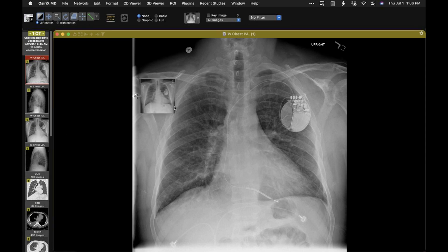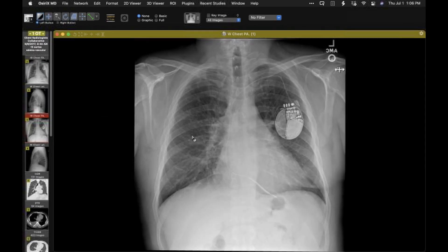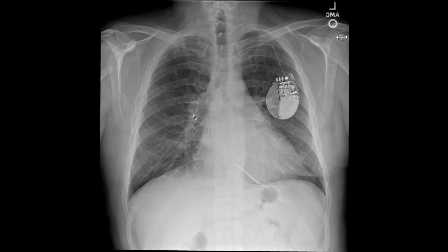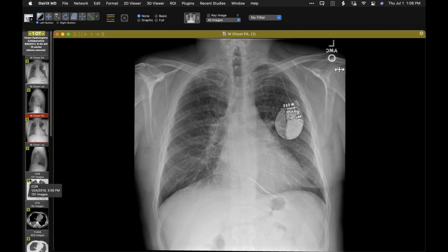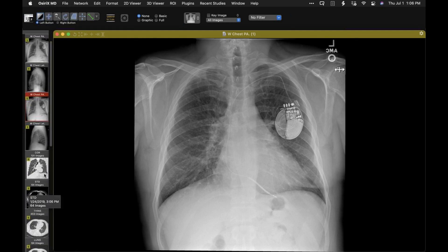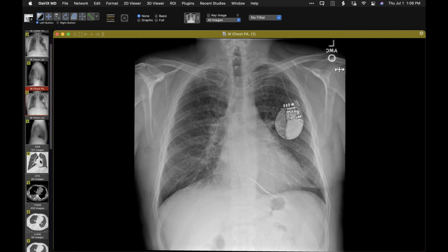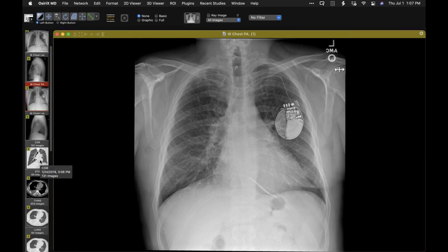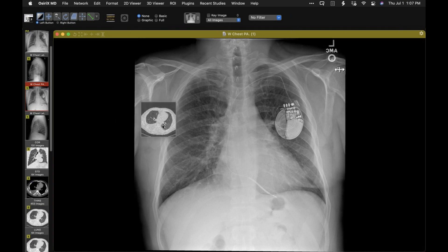Let's go forward in time. Here is 2019, and perhaps again there's a peribronchial fluid cuff or two, maybe a septal line or two or three, but again subtly asymmetric on the right side. I was reading some of his notes and saw that one of the things he had for a long time was a unilateral right pleural effusion that wasn't really explained.